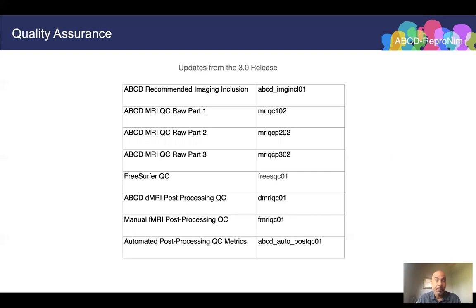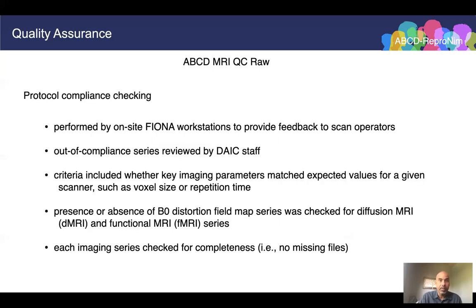The first part will be on the QC of the raw data. There are several parts here. There's also QC on the post-processed data as well, and we'll go over bits of all of that.